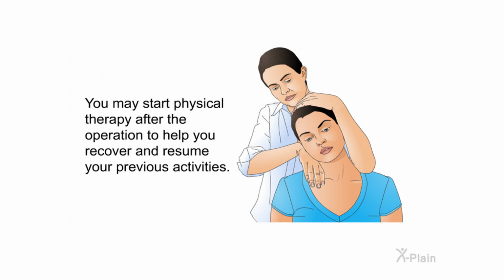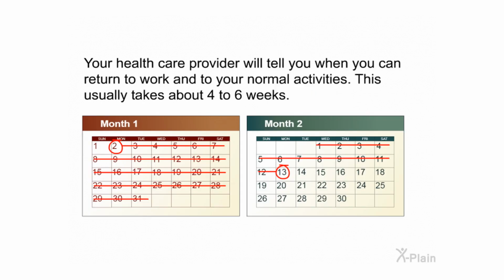You may start physical therapy after the operation to help you recover and resume your previous activities. Your healthcare provider will tell you when you can return to work and to your normal activities. This usually takes about 4 to 6 weeks.